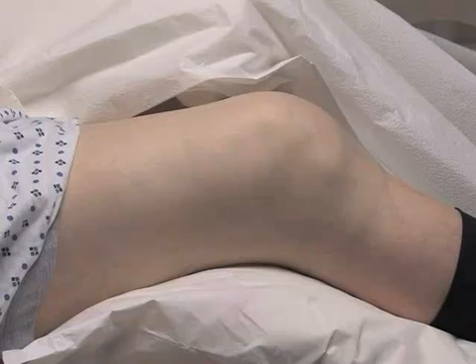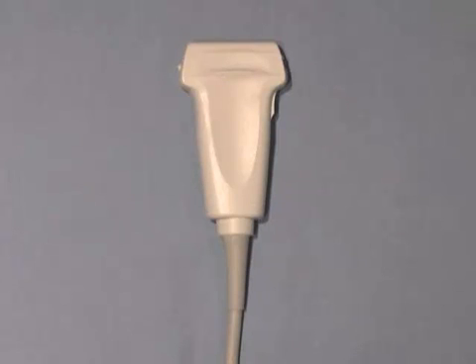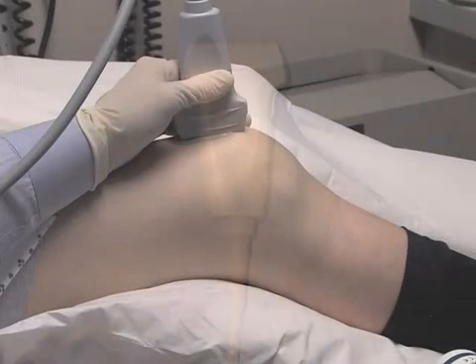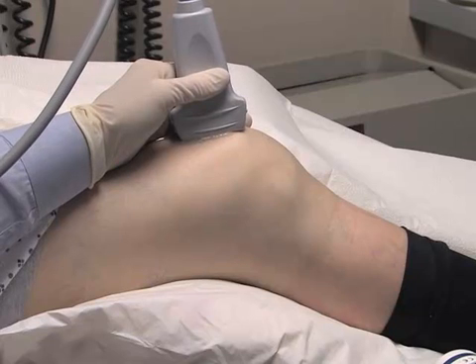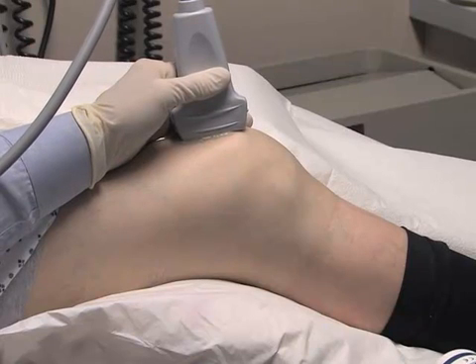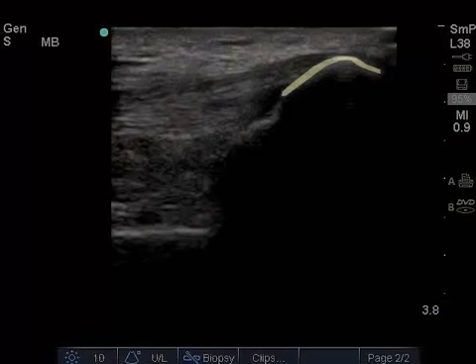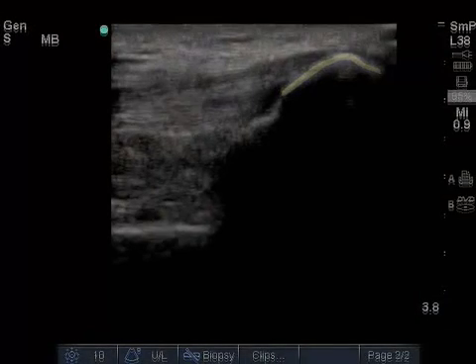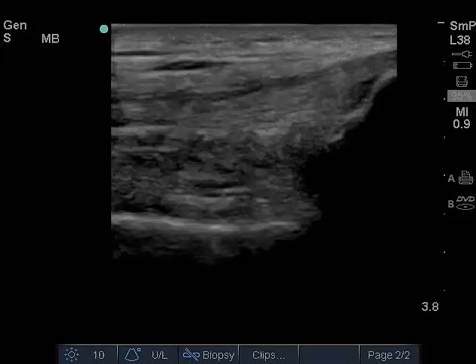The patient should be in a supine position with the affected knee slightly flexed. A high-frequency linear transducer is optimal for this application due to its high spatial resolution and short focal length. Place the transducer in a longitudinal position anteriorly, just cephalad to the patella, with the directional indicator pointing towards the patient's head. The cortex of the patella can be seen on the right of the ultrasound screen as an echogenic line that casts a shadow into the far field.